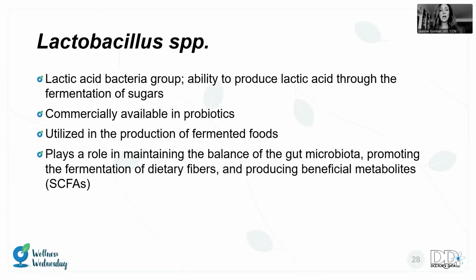Lactobacillus is next, also commercially available, has a lot of uses in the gut. Low Lactobacillus can look like IBD, look like IBS in terms of some of the symptoms, but if we can get that Lactobacillus back up, some of that does resolve, of course. Important to maintain this species for sure.